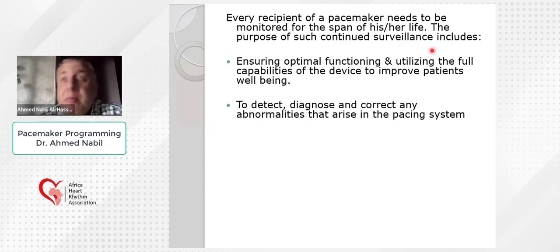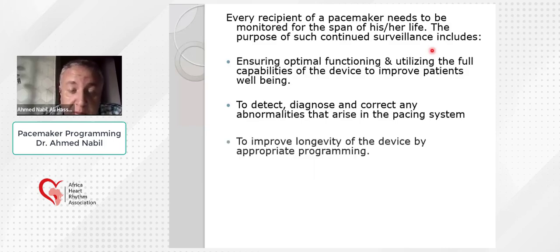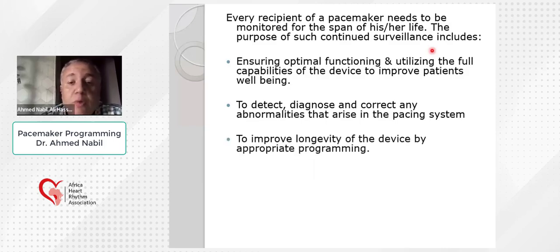Also, programming is needed to detect and diagnose any abnormality that arises in the pacing system. If we have a problem in pacing, or in the sensing or the functions of the pacemaker, programming is very important to detect any abnormality or dysfunction. Also, we have a goal to improve the longevity of the device by appropriate programming, and we will see how to program the pacemaker to improve its longevity as much as possible.